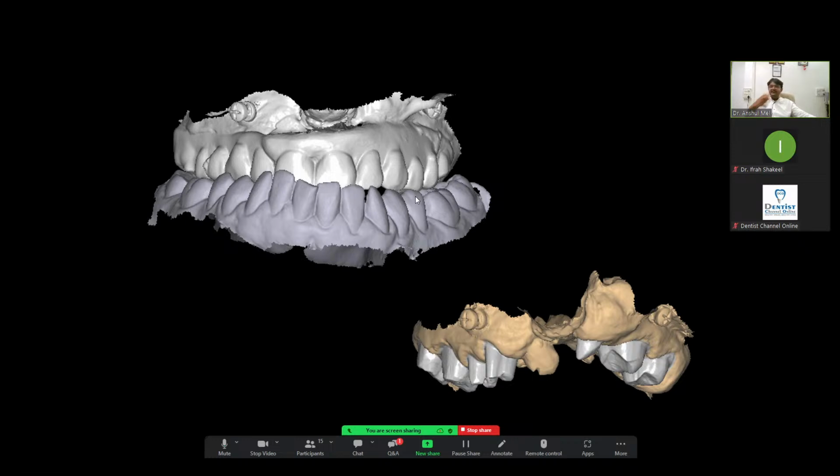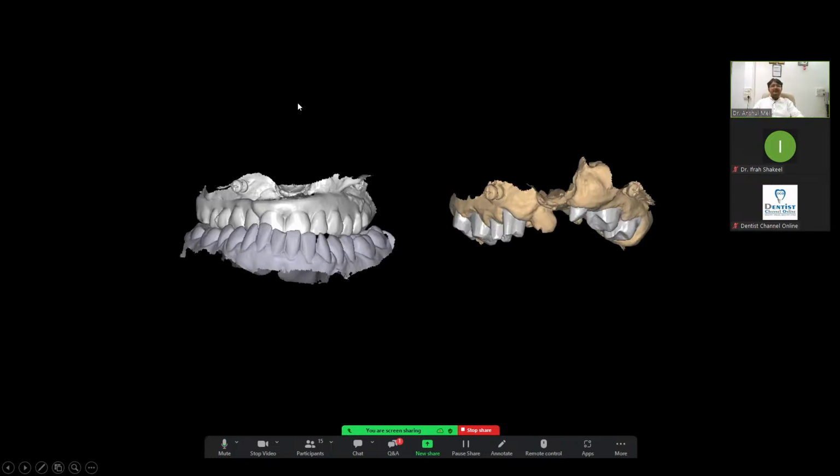After that, we start preparing the teeth. After preparation, we have a prepared tooth in this scan, and my mini implants are there on top of it. Now I can superimpose this post-operative scan with the pre-operative mock-up, using this pin as a marker. So I will get the perfect occlusion in my final. This is my superimposition point, and then I will start designing the same bridge that I gave to the patient, and then we insert.